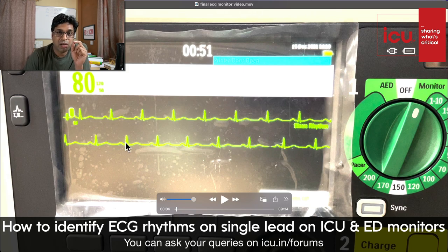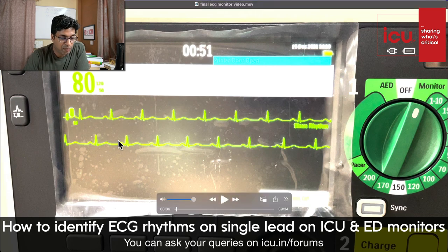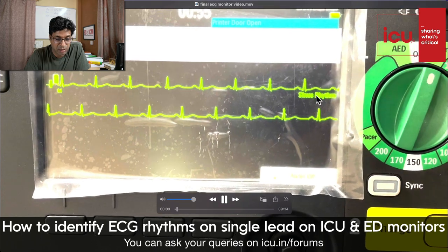Remember, any QRS complex which is originating in the atria and crossing through the AV node will be a narrow complex. And any QRS complex which is a broad complex is getting originated in the ventricles. So a QRS complex passing through the AV node will be narrow, and any QRS which is generating in the ventricles themselves will be broad. So here the P wave is there, there is a narrow QRS complex, and this is a pretty regular rhythm, sinus rhythm. Everybody knows this. Even the monitor is saying that.